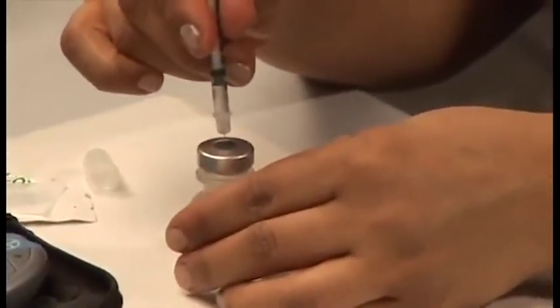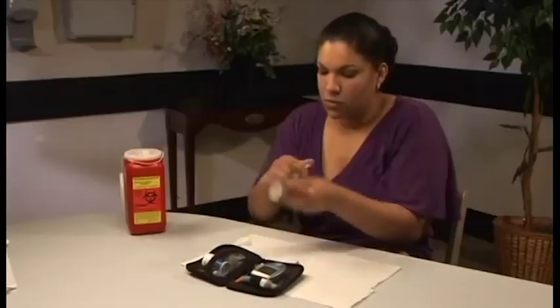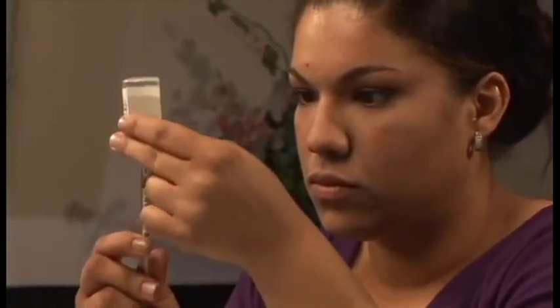Take the cap off the syringe and pull the plunger to fill the syringe with air equal to the amount of insulin you will be giving yourself. Put the needle straight through the rubber stopper, push the air out of the plunger, keep the syringe in the bottle, and turn both upside down. Make sure the insulin covers the tip of the needle.